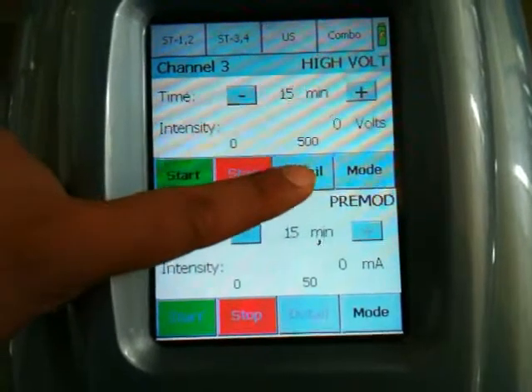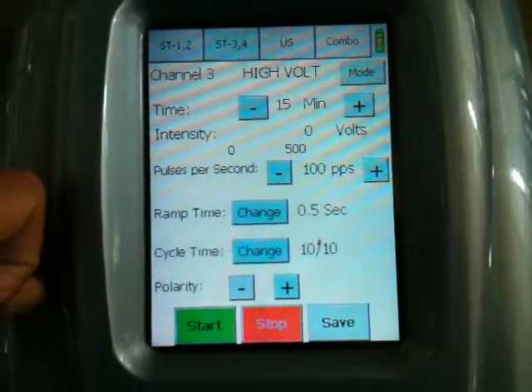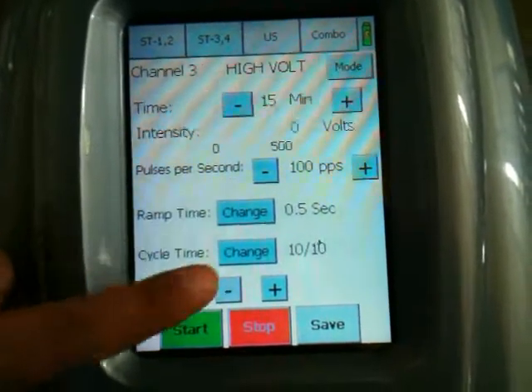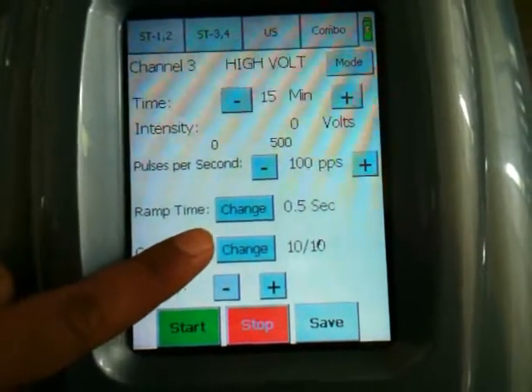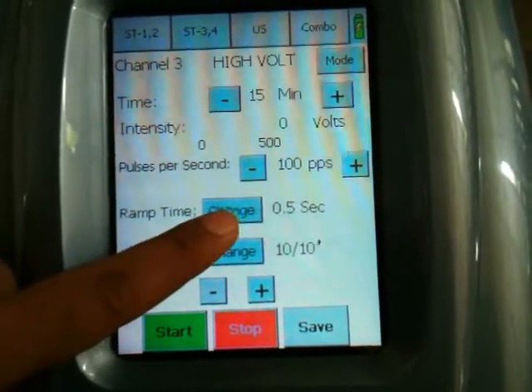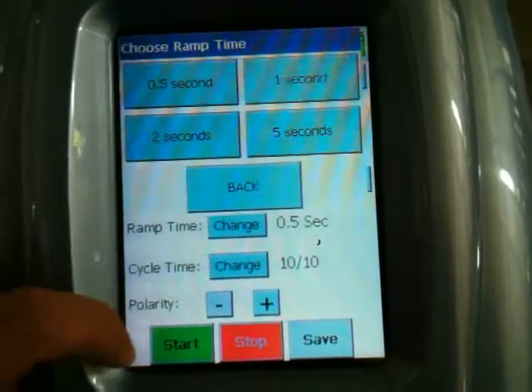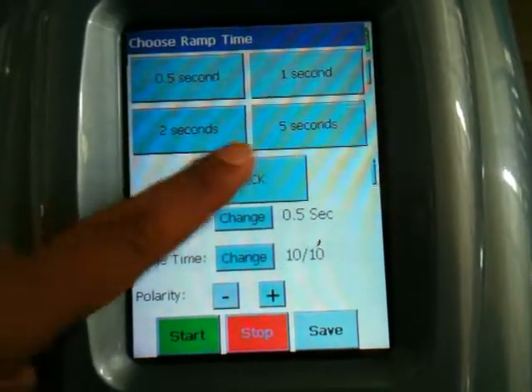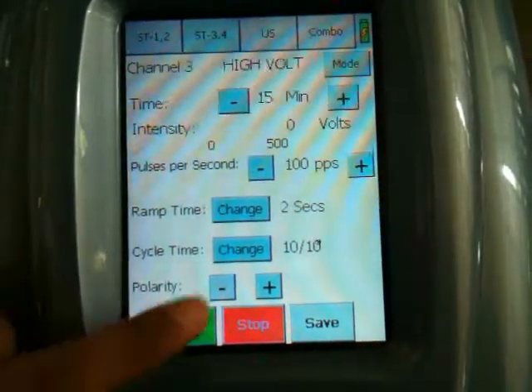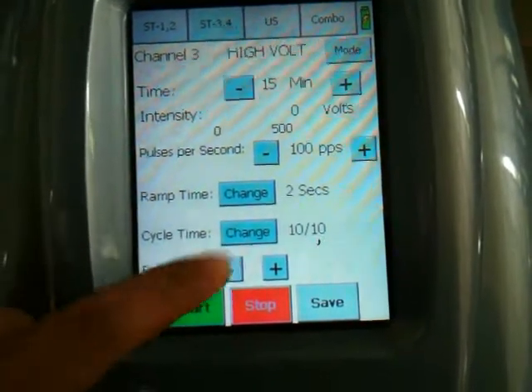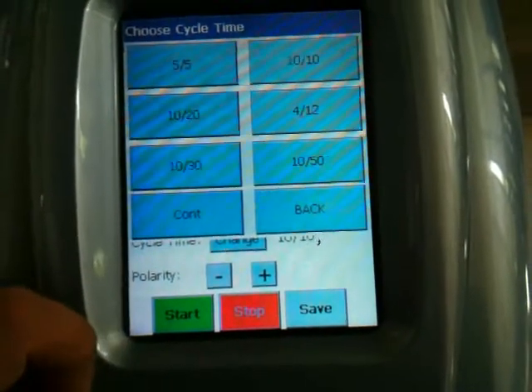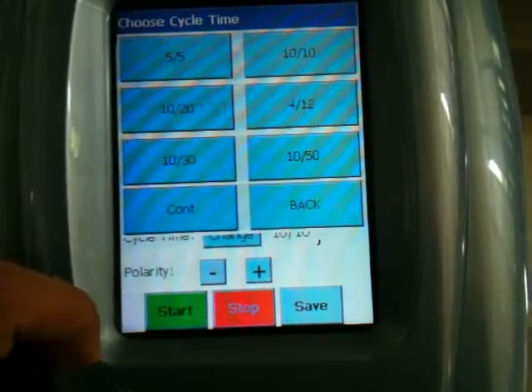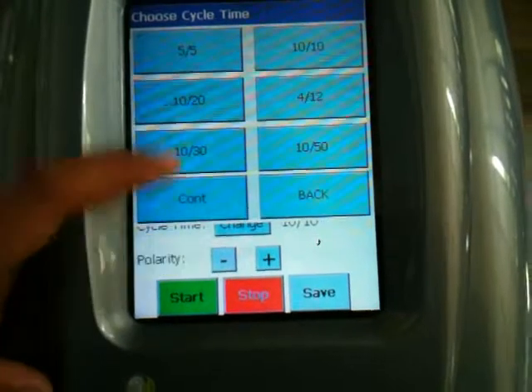We can press the detail button to set the parameters of hi-volt. Time and pulse per second — we can increase and decrease. Ramp time: we can select 0.5 seconds, 1 second, 2 seconds, and 5 seconds. Cyclic time: 5 by 5, 10 by 20, 10 by 30. Continuous: 10 by 10, 4 by 12, 10 by 50.